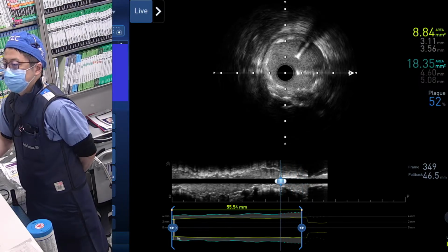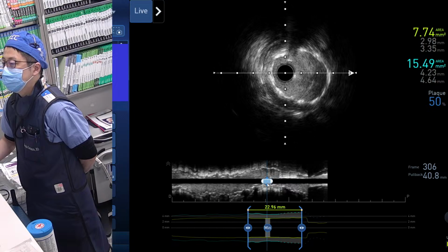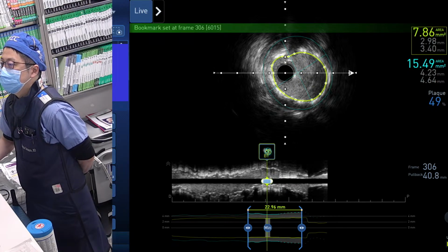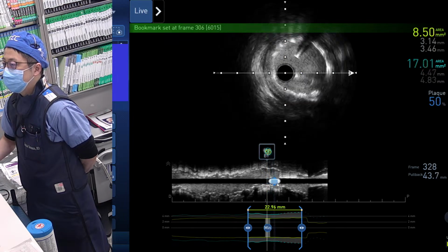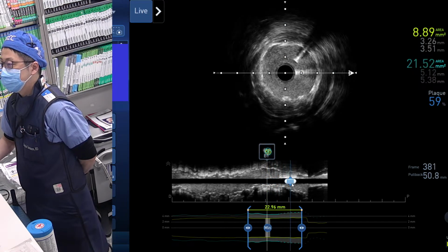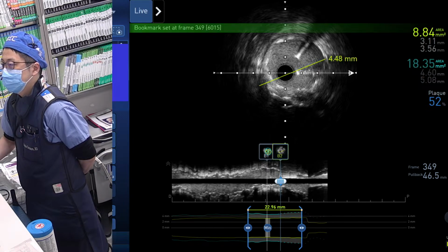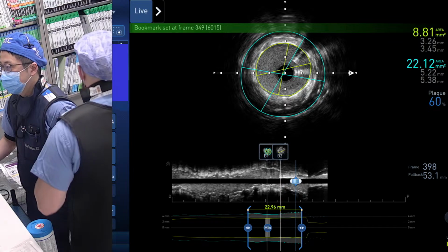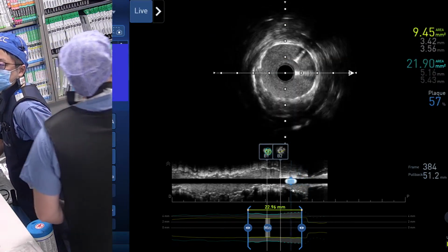So like 8. Area-wise, it's good. Actually, the vessel size is like a 4.0. If you want, you can expand more. But area, MSA, yeah. You want to go with 4.0 post? Anyway, area is good because 8. But the proximal part of the vessel is like more than 4.0 vessel. Huh? 4.0. Let's see the last angio. Okay, take a picture. Yeah, we have to see the picture now.